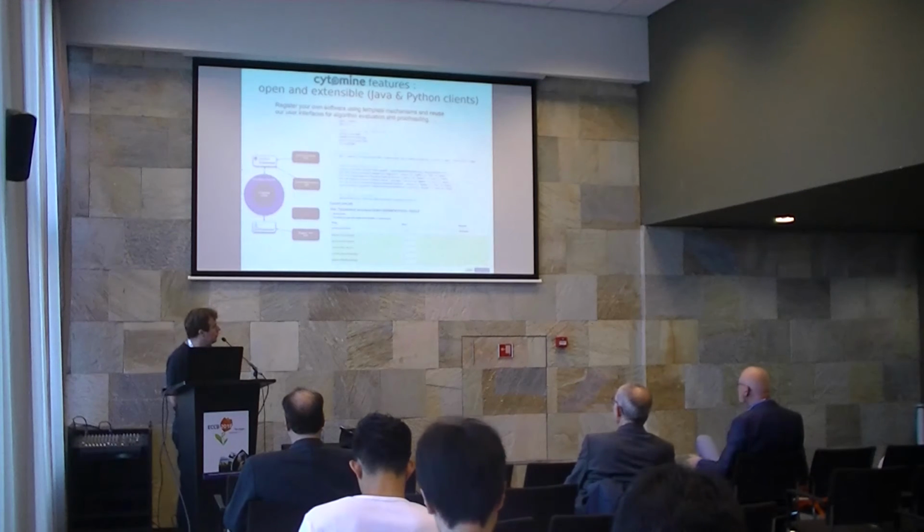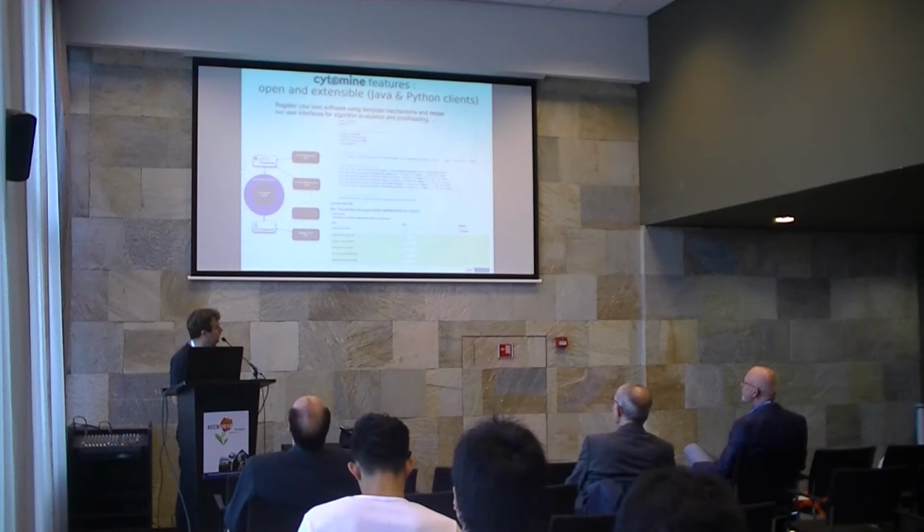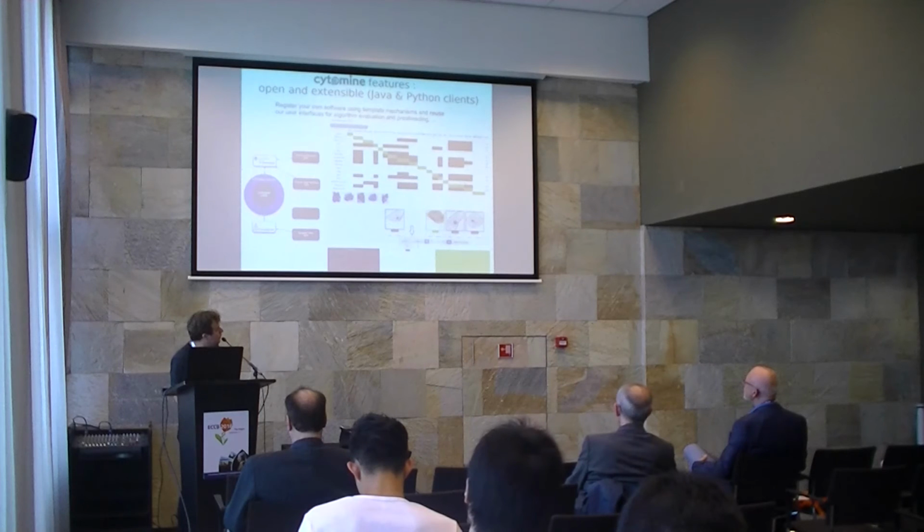And you can also plug in your own software. You define your software, you give it a name, you give it its parameter types and parameter values, and then you can reuse our previously designed user interface. So for example, let's imagine that you have an object classification algorithm using a certain flavor of deep learning. You can register the algorithm, and then you can reuse our user interface. For example, this user interface allows you to visualize a confusion matrix to see how well your algorithm is performing.